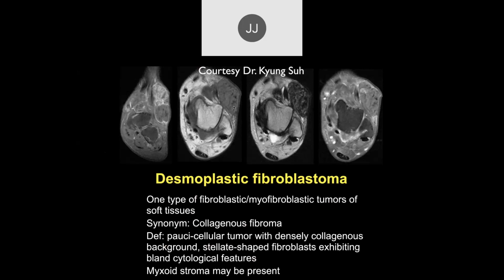Yeah. I just want to know, when they're this inhomogeneous, I've seen some lesions that really don't look like they're infiltrating, but ended up being malignant. So, yeah, again, if in doubt, remember, you can't really exclude malignancy unless it's one of the very unusual, obvious lesions that we all know about.